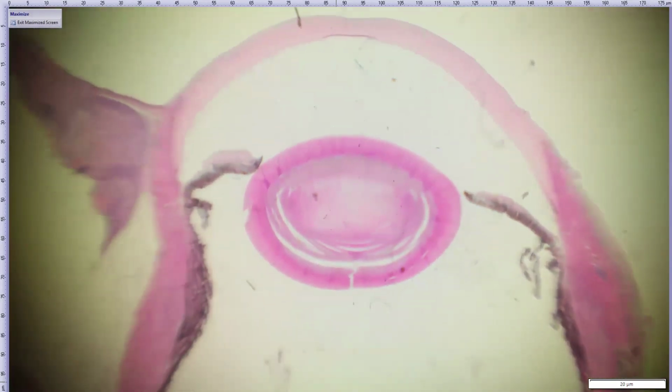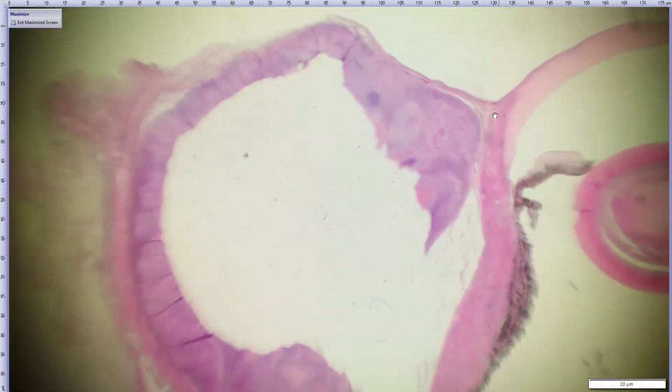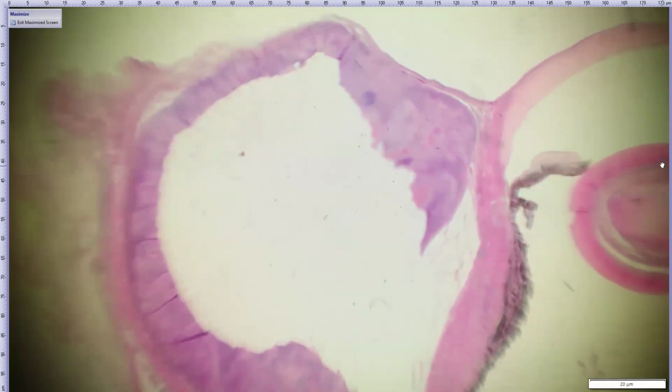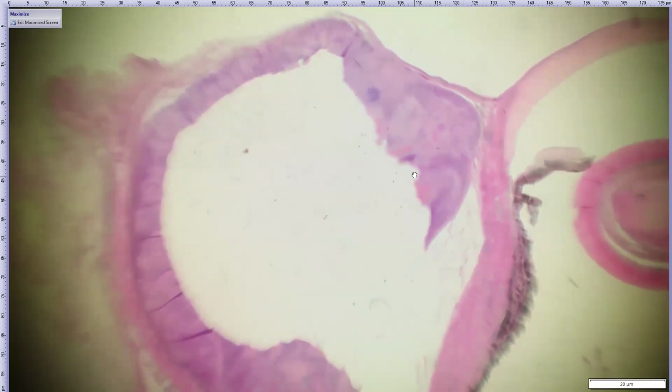So our actual intraocular structures do look rather unremarkable, so I probably won't talk about them too much. What I want to focus on is our large mass in the episcleral tissue. It got chunked out during processing, so we kind of lost the core of the mass, which is just an artifact. We can ignore that. There's plenty of diagnostic tissue at the fringes of this mass.